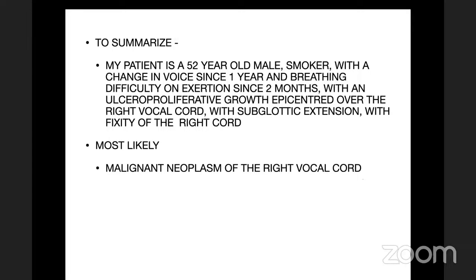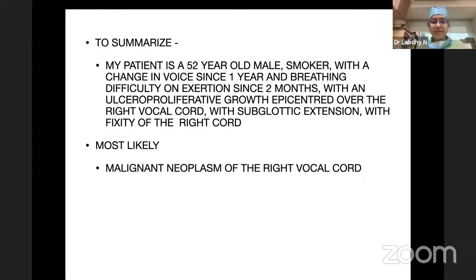Okay, Labdi, hello. Yes, sir. So, what is the stage of your case? Clinically, it is a T3 and above lesion, but I would like to do a radiological assessment to correctly grade and stage. Agreed. T3 what?